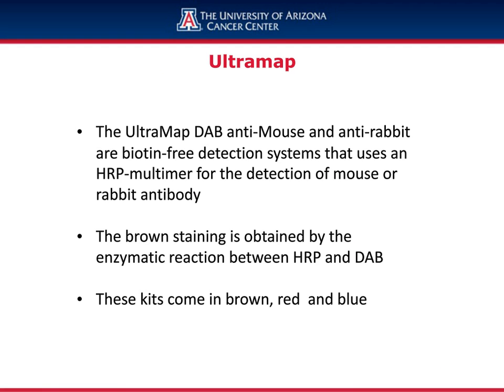Ultramap is used in conjunction with the DAB, as I've said previously, if these are low-expressing proteins, because low-expressing proteins do not come out very well with DABs. They either show a blush or they show no staining at all.